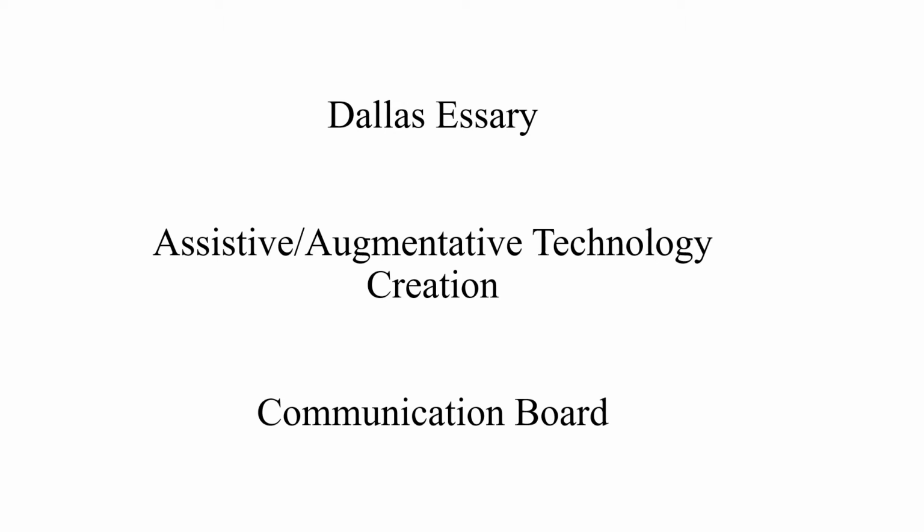The device I chose today was a communication board. I have used this type of device before with students who have autism. Some of these students have been nonverbal, minimally verbal, or emergent communicators. The students I've worked with are preschool aged children, 5 to 6 years old.